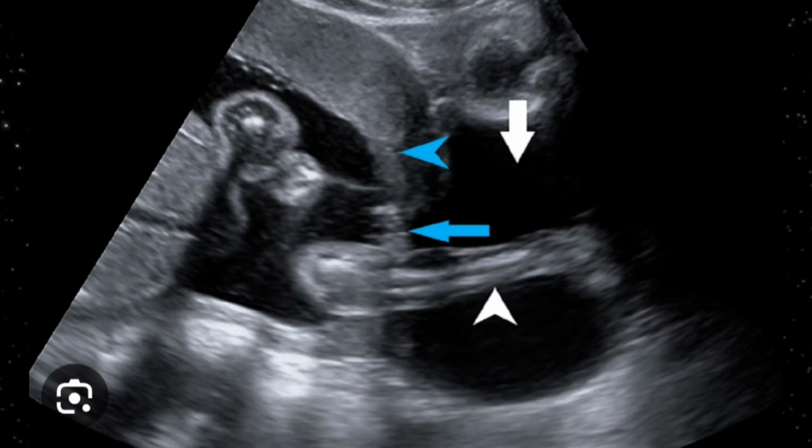On this ultrasound image, the findings show the ultimate outcomes of cervical incompetence. On this image, you can appreciate that the cervical canal is completely filled with fluid, and one of the limbs of the fetus has come out of the internal os, and it is in the endocervical canal.